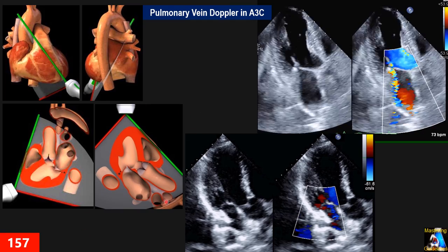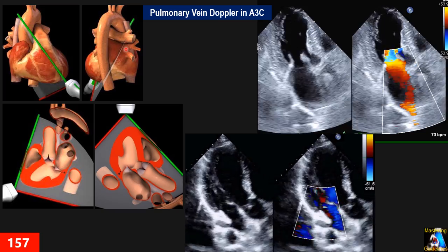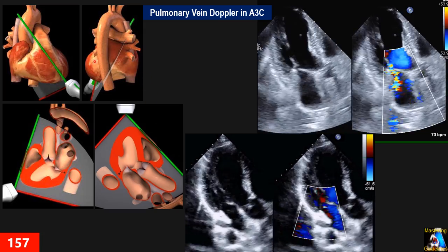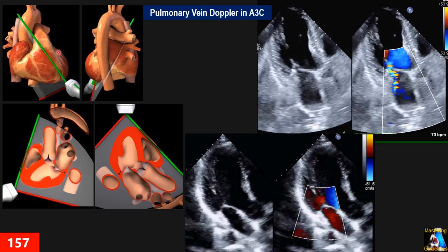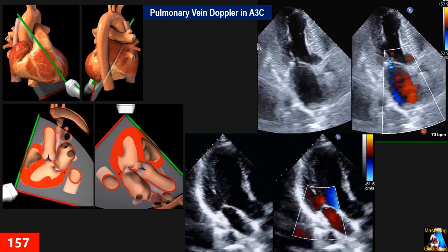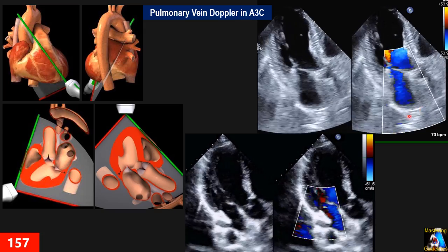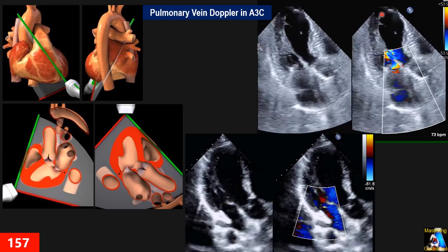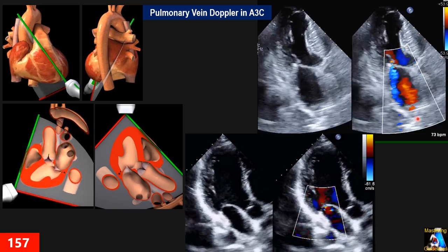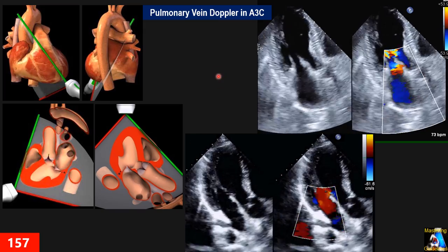Pulmonary vein Doppler from the apical three-chamber view: here our sector passes through close to the entrance of both right pulmonary veins. To get pulmonary vein Doppler from this window, fan a little to the right of the patient or twist a little more counterclockwise. Suddenly you can find the right pulmonary vein — it may not be clear whether it's upper or lower, but either is fine. Our cursor becomes parallel to the flow, allowing a very nice pulsed wave Doppler on the pulmonary vein. The area near the entrance is a perfect spot for placing the sample volume.